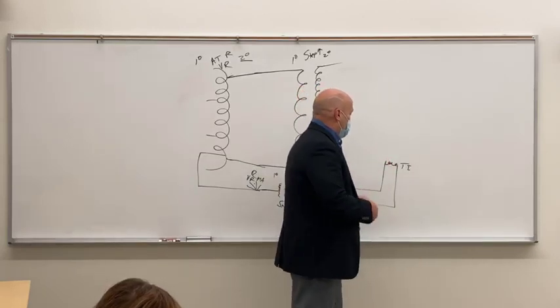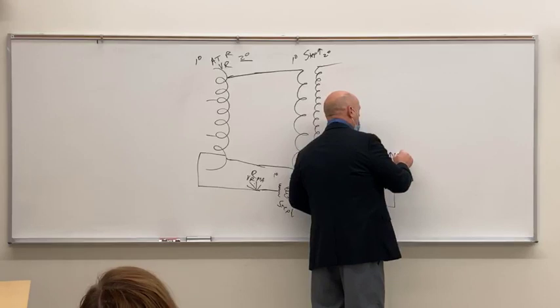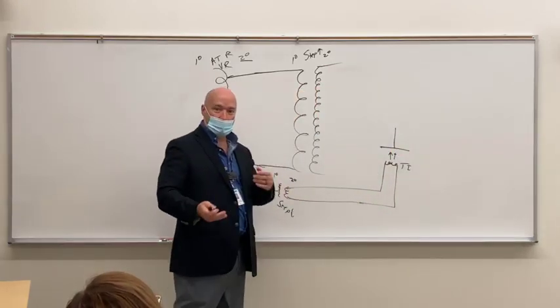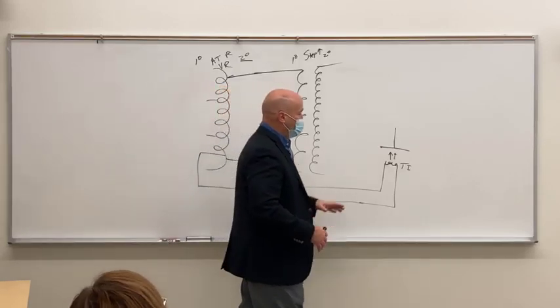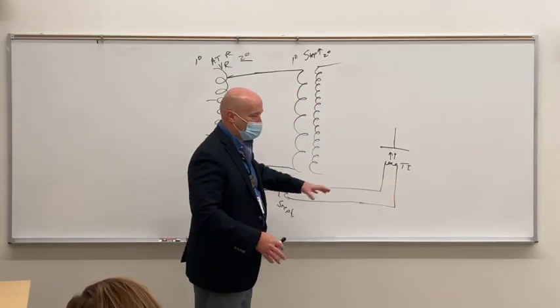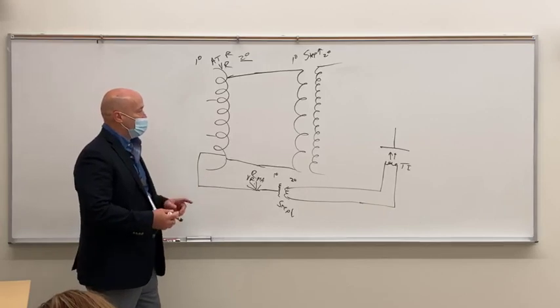And even if that doesn't crack, if you take all those electrons and send them across the tube when you make your exposure, and they hit that big plate and that big plate is cold, then what's going to happen to the plate? It's going to crack it, right? So there's always a filament current running. We didn't touch on that, but just be aware there's always a filament current running through that.